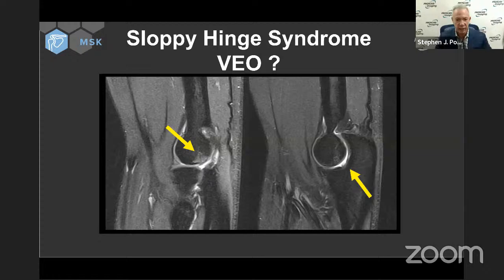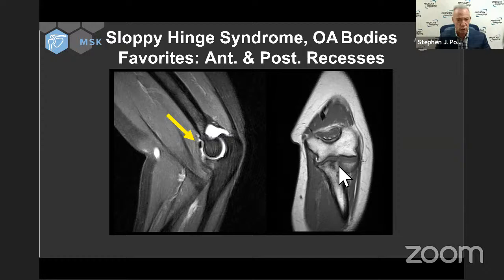We also said earlier that there are normal areas of irregularity and vascular grooves in the back of the capitellum. So those are two important variations. Back of the capitellum irregularity, and right in the trochlear groove, seen in the sagittal projection almost exclusively.